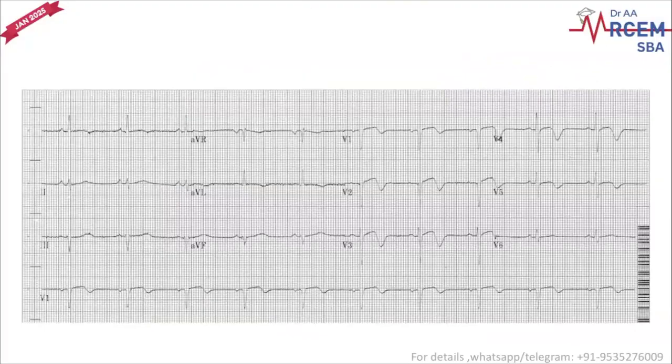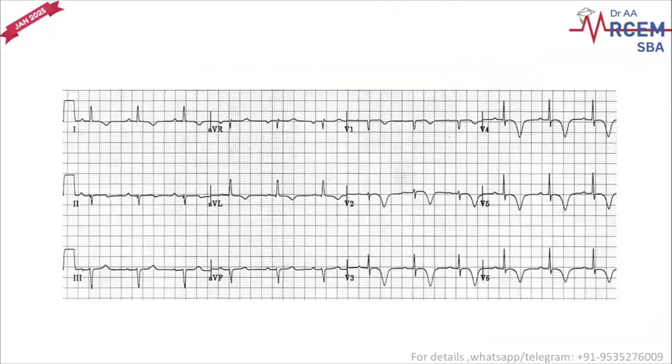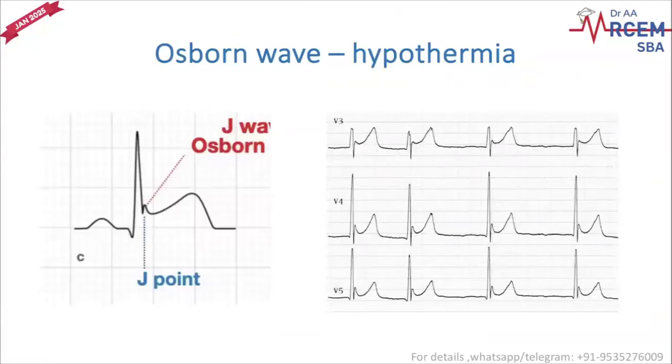Let's take a proper ECG. We are taking V2 and V3. We are seeing a biphasic T wave pattern. This is Wellens syndrome. Again, deep inverted T waves are seen in V2 and V3. This is also a Wellens syndrome that we are having.